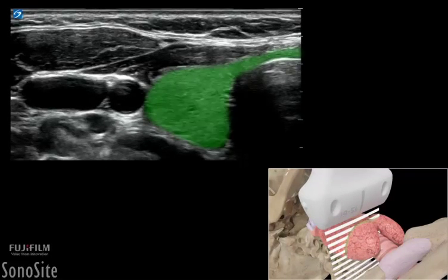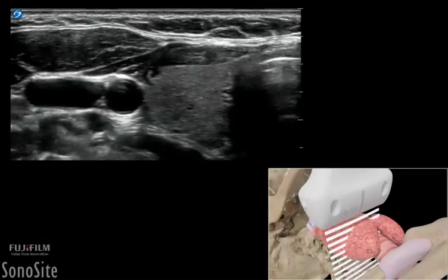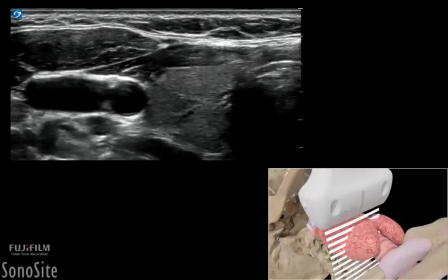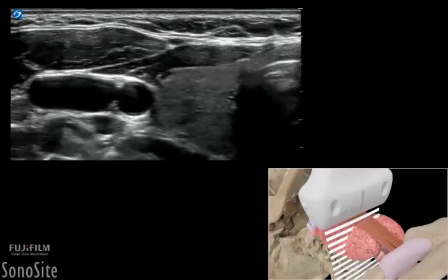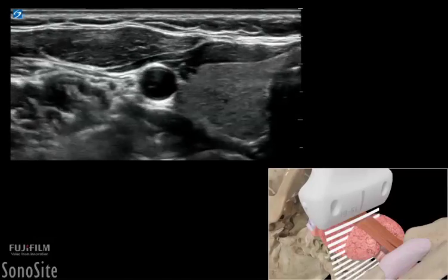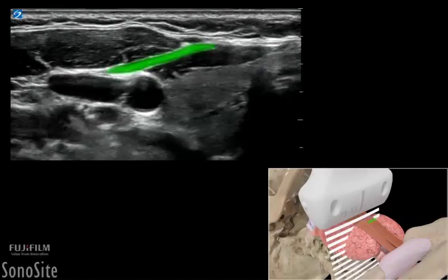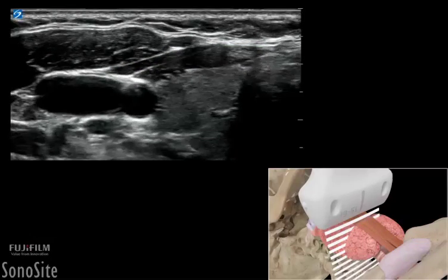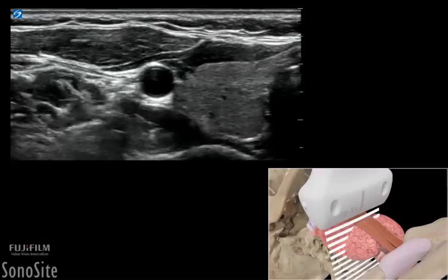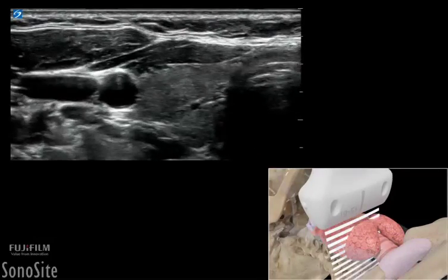The thyroid will appear as a light gray or slightly hyperechoic structure when compared to the surrounding muscles. The muscles seen closest to the transducer and anterior to the thyroid are the sternohyoid and sternothyroid muscles, while the jugular vein and the carotid artery can be seen lateral and slightly posterior to the thyroid gland.